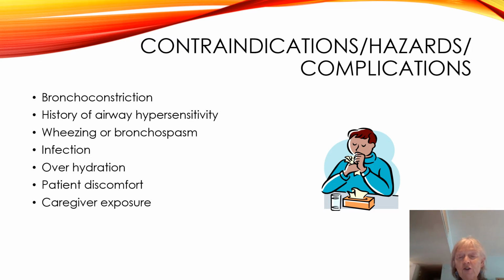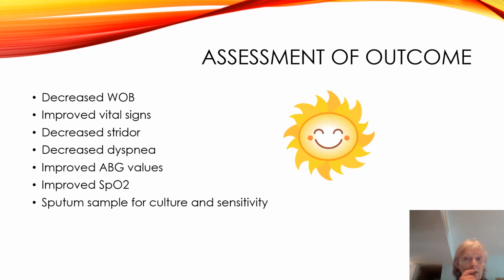Some of your manufacturers have come out with small volume nebulizers. They're fairly self-contained. Not all of them have, and the FDA hasn't really come out and said that they have to do it. I think somewhere along the line we're going to start to see that, and they are going to mandate it at that particular point.